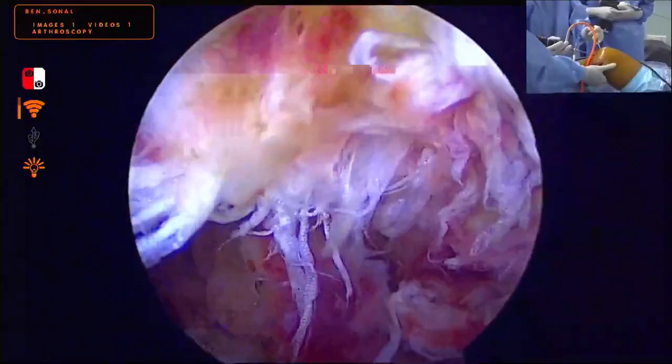Green native please. Leave it, don't break it. So now relax. Okay, so hold this. Just hold. So now this one is my pulling thread.